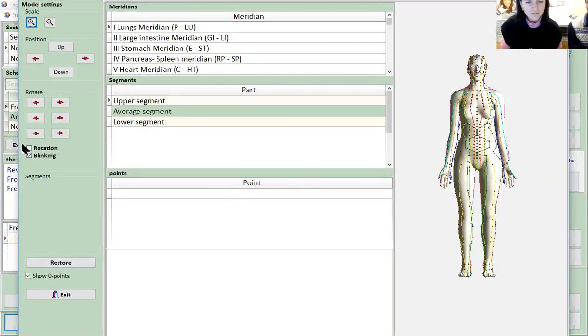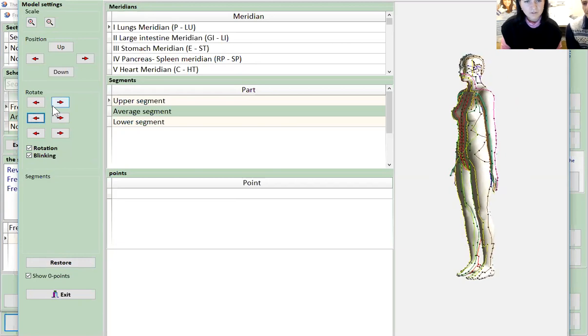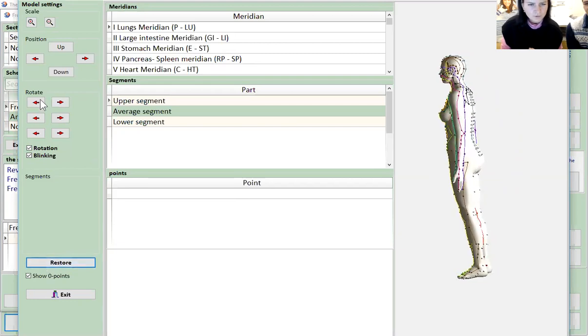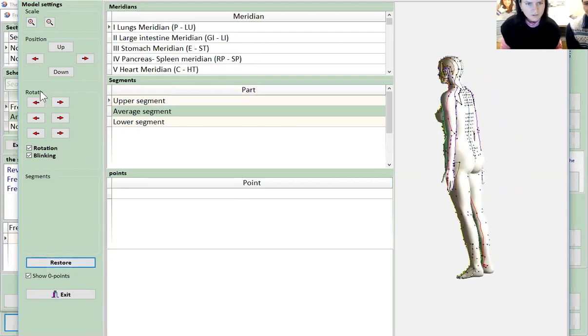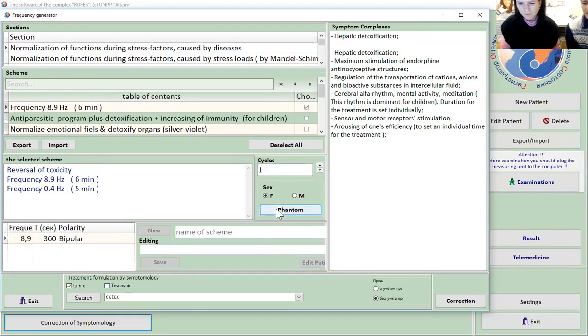Also, you can do this rotation, so it will move to whichever side you want, and then restore back. Now, show where this one is. Exit. Yeah, back. Actually, when you do, for example, where can I do? Yeah, normalize. No, not here. It's on the other one.